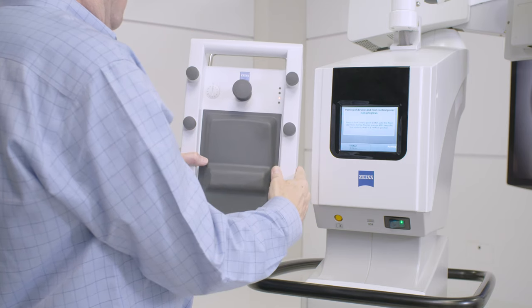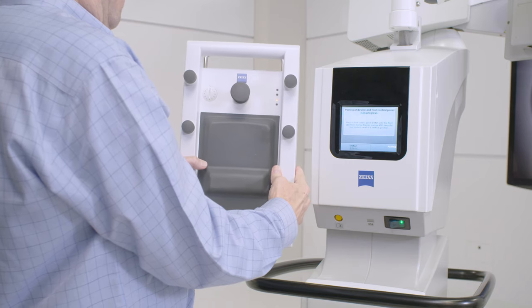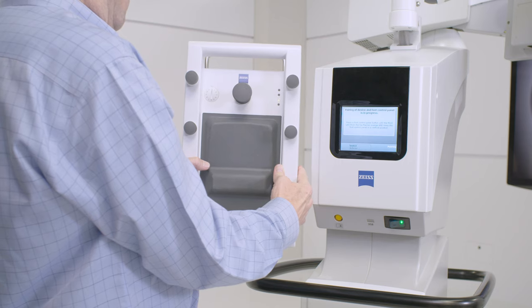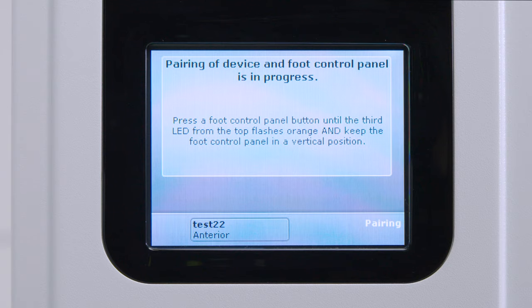Once blinking, pairing is in process and you can let go of the button. Continue to hold the Wireless Foot Control Panel in the vertical position until the pairing process is complete. When successful pairing is complete, the touch screen will show pairing successfully completed.